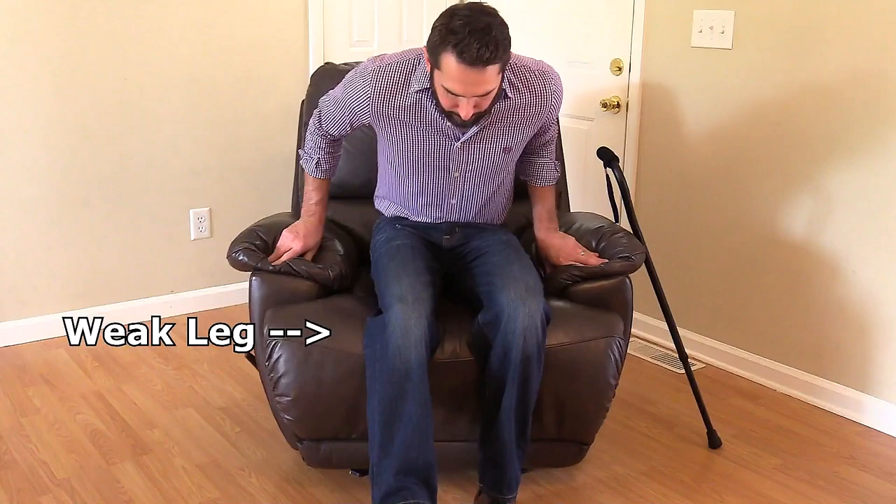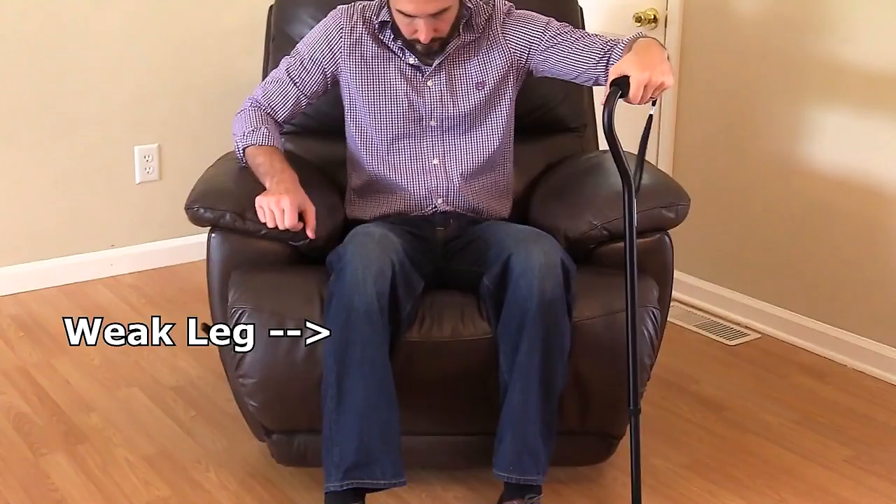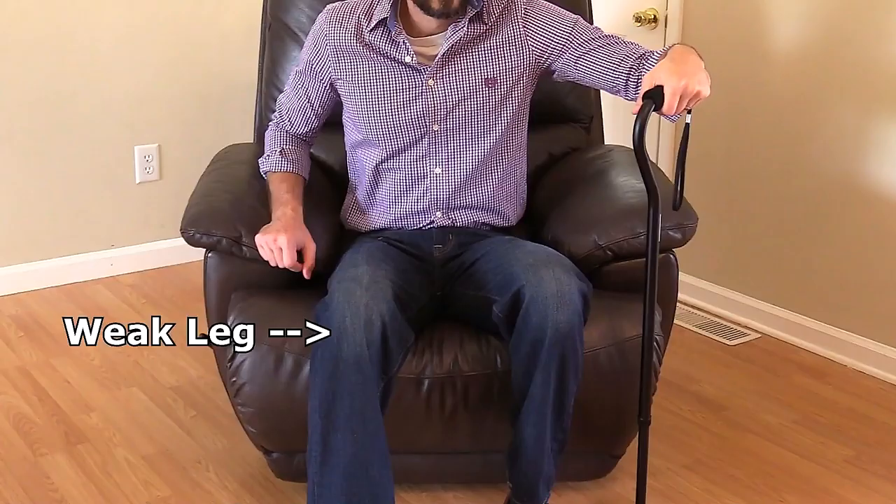To stand up with the cane, the patient is going to place the cane on the strong side and lean forward in the chair while keeping the weak leg slightly extended forward. Then the patient is going to push down on the cane's hand grip and the chair armrest, then put weight on the strong leg and stand in position with the cane.